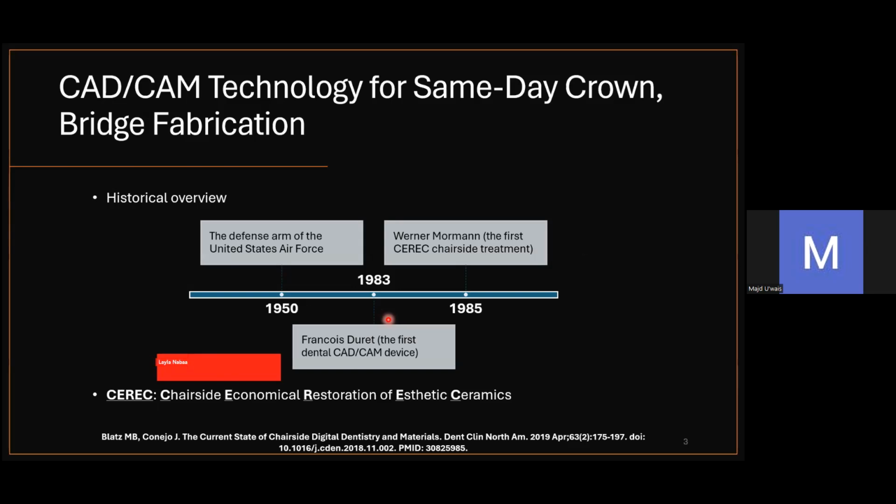First topic, the CAD/CAM technology for the same-day crown bridge fabrication. This is a historical review of the development of chairside CAD/CAM technology, as you can see. First, the CAD/CAM systems were initially developed in 1950 by the Defense Arm of the United States Air Force for aircraft manufacturing. And it took 3 decades until such technologies were applied in dentistry.